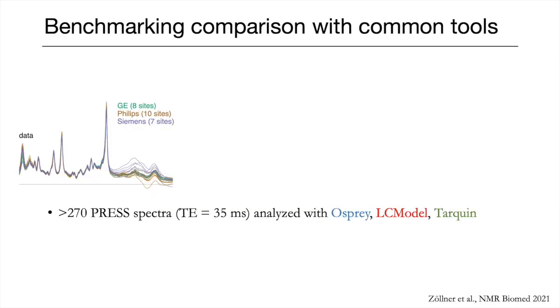When you are using different tools to analyze your data, it is very likely that you will see different results. Different results occur as a result of different processing, modeling, and quantification routines. Even when you use the exact same pre-processing pipelines, different modeling algorithms might not agree well.